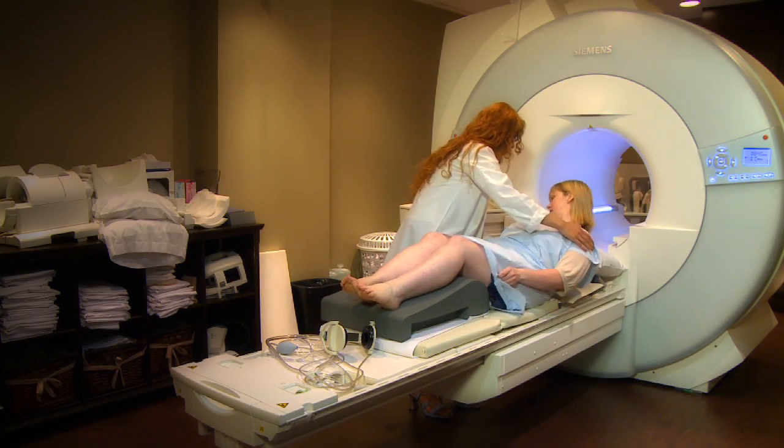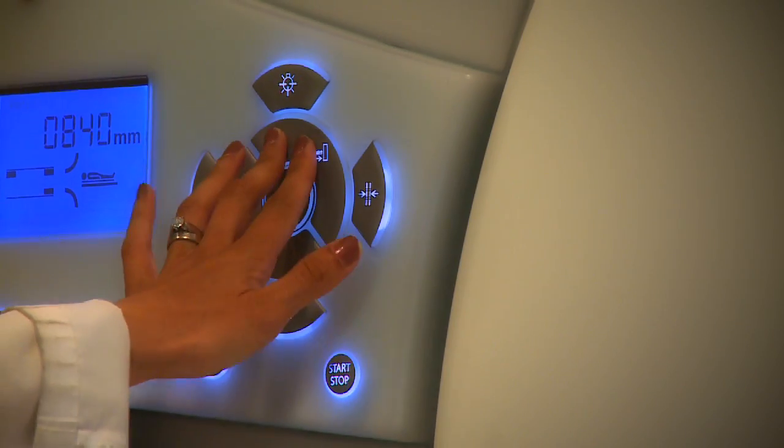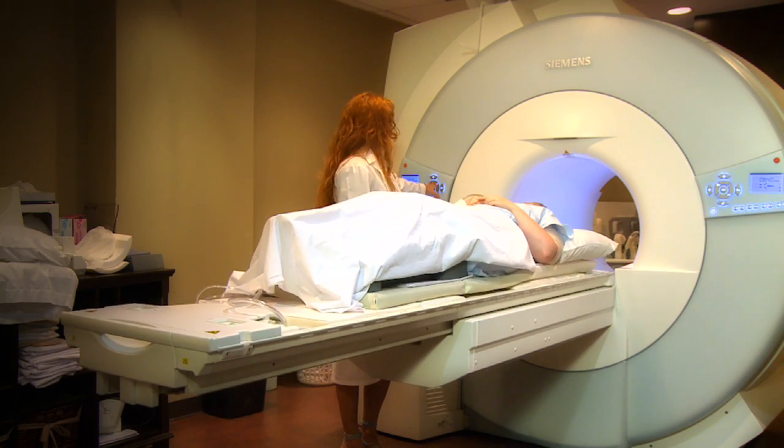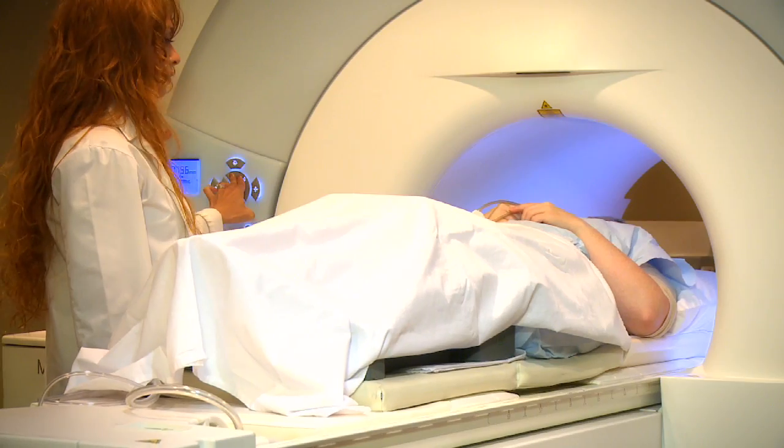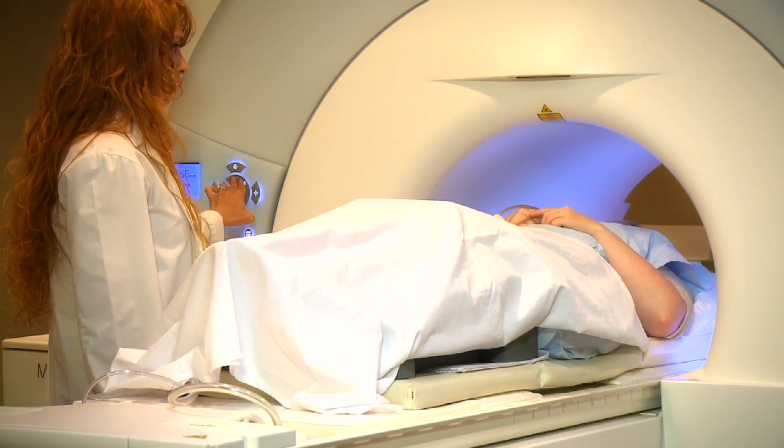We look for aneurysms of the chest or abdominal aorta. We also look for aneurysms within the brain vessels, and we also with MR have the ability to evaluate and detect tumors or malignancies of the kidneys, the liver, and also evaluate the female ovaries looking for cysts or tumors of the ovary.